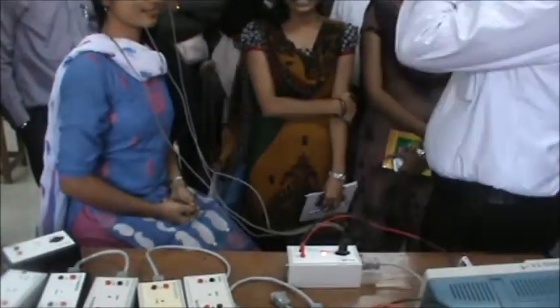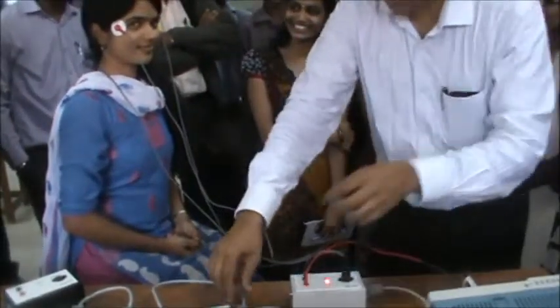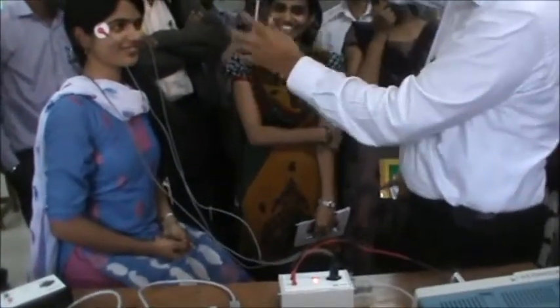Let's say you should not move your head left or right. Only your eyeball should move. So I'll just make a small mark. You focus on this.